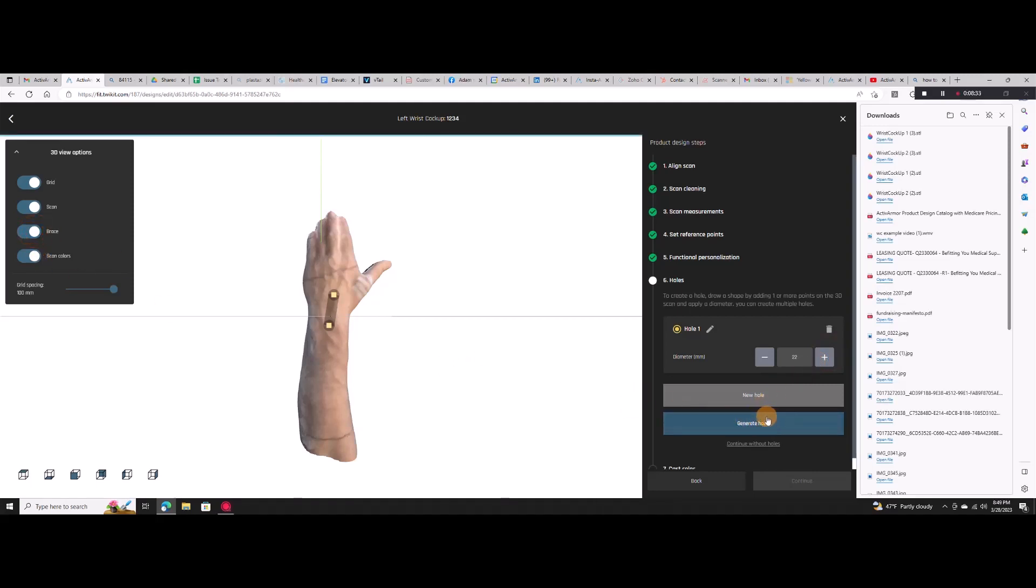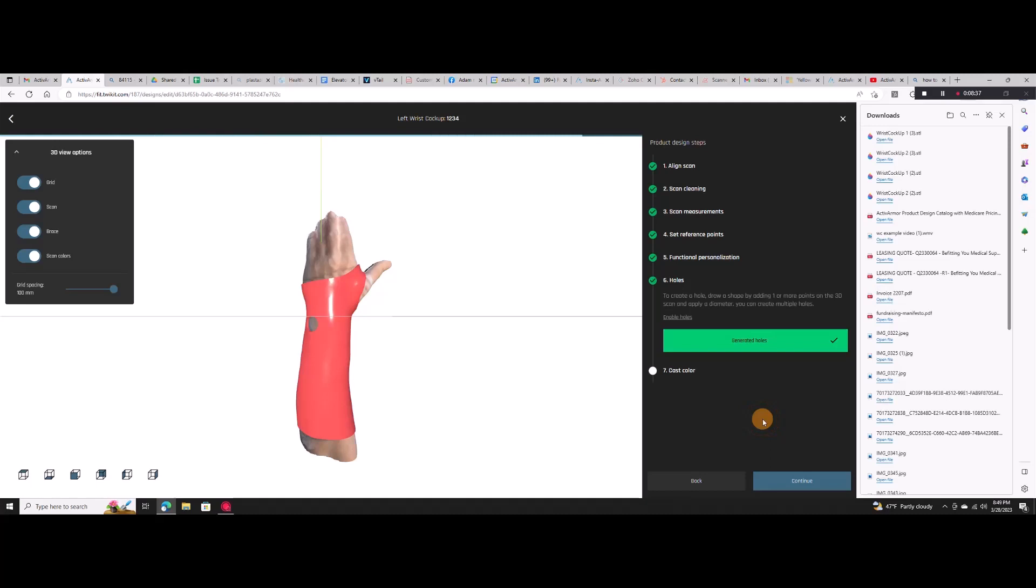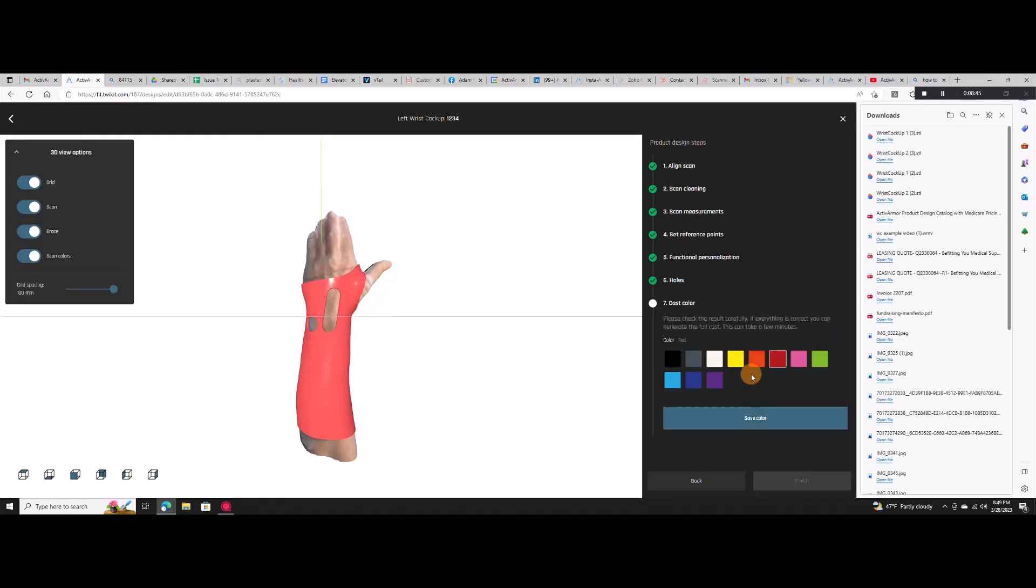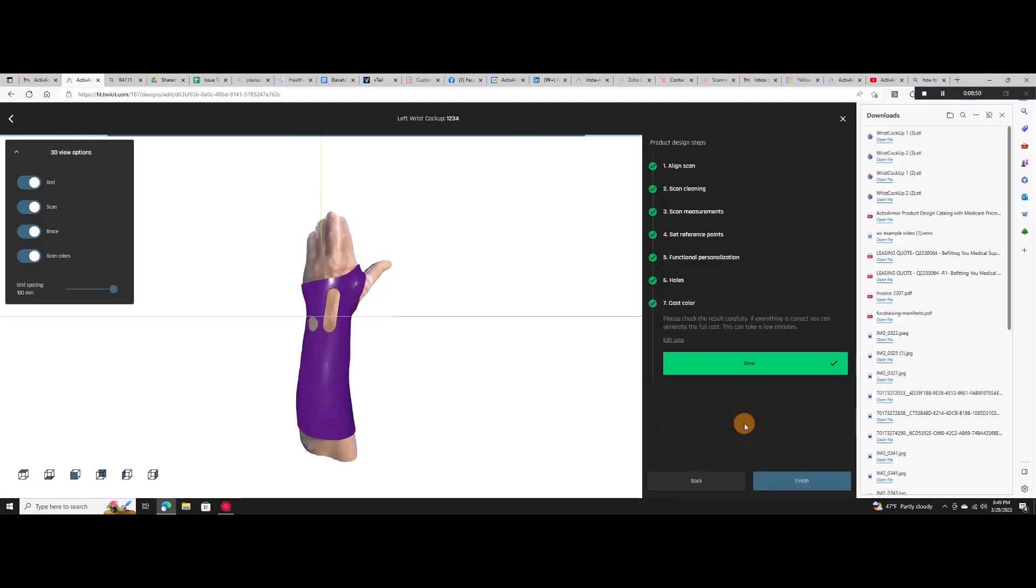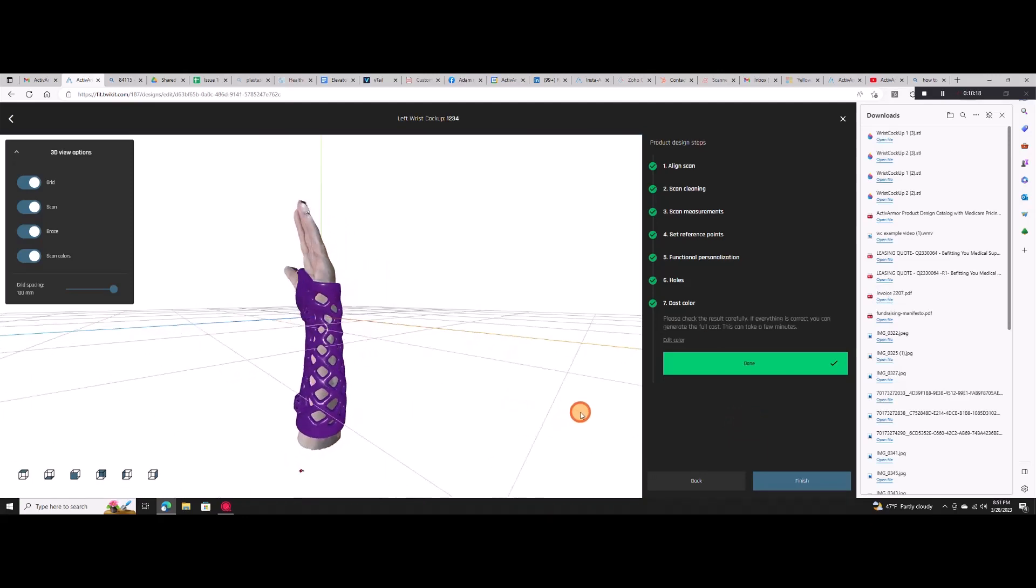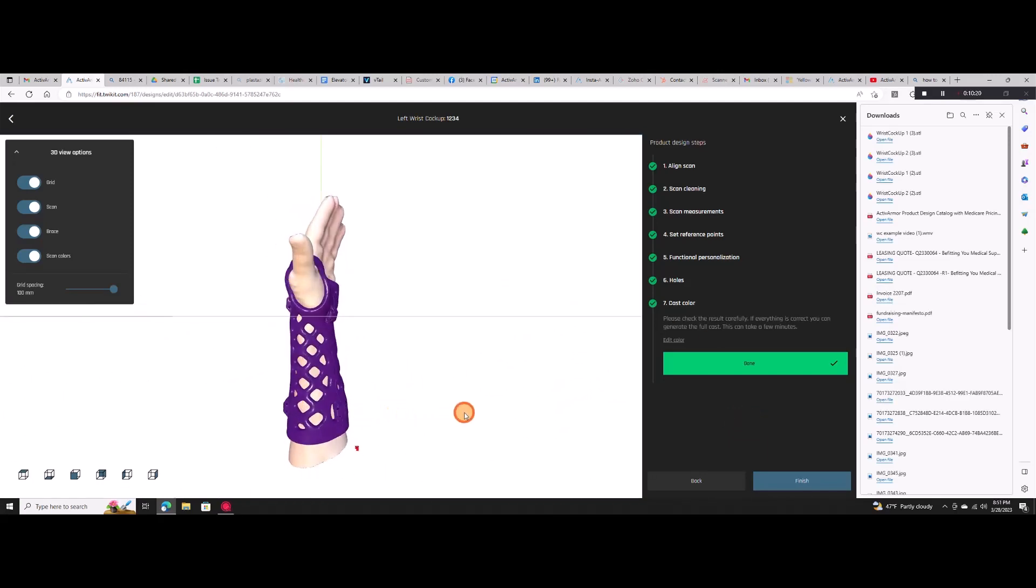You choose the size, shape, and location of any holes or offsets. Finally, pick your color and wait for the final brace to appear. You can go back and make any changes at any time.